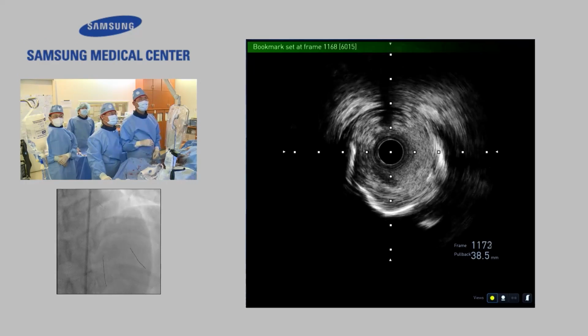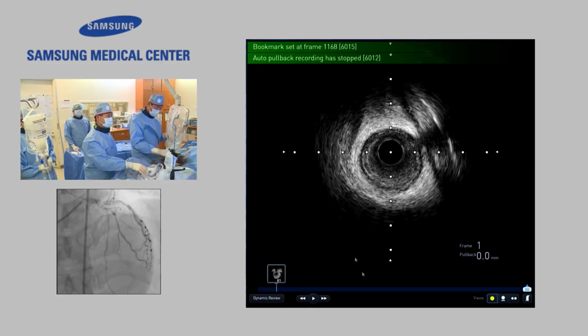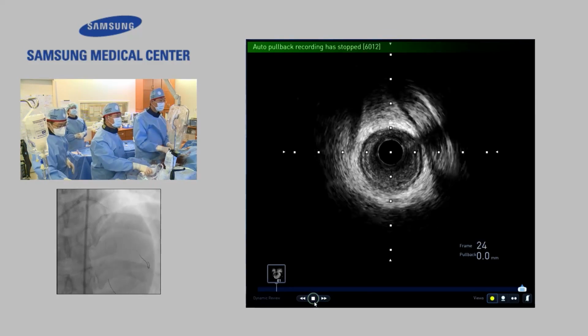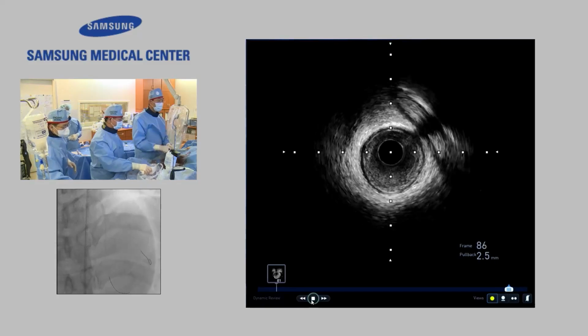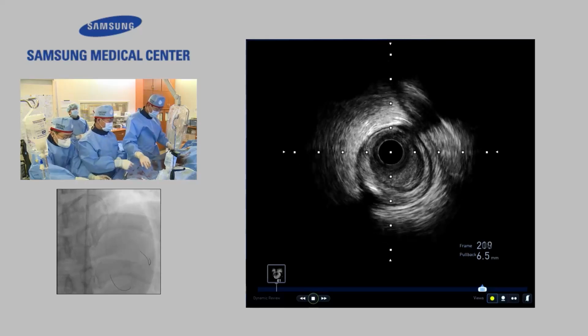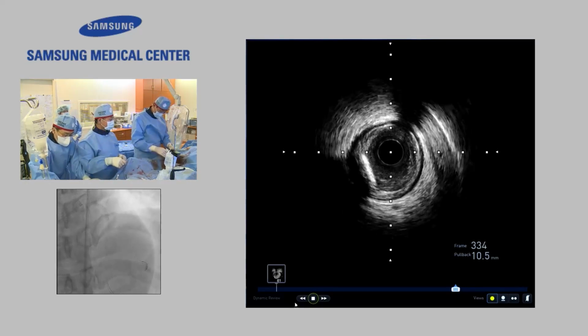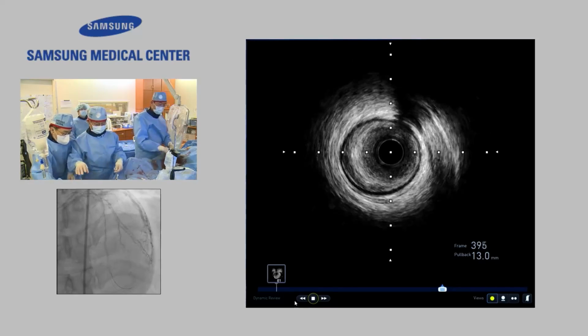Okay, stop. Very good. So maybe you can decide to stent? Yes, I think the vessel is quite big. I decide on a stent technique, but which technique, don't ask me, because the TAP technique is my preferred one every time.